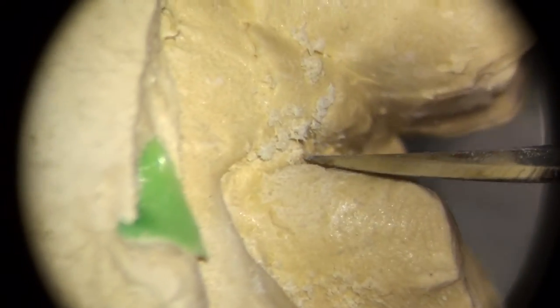So we'll try and trim that a little smoother. Fortunately, being a bicuspid, we can use maybe a little bulk out there. But if we try to fit our crown around a drag like that, then we end up with a huge, big, bulky gum line, and that doesn't work. It becomes a maintenance nightmare, an aesthetic nightmare, and maybe bother the patient's tongue.